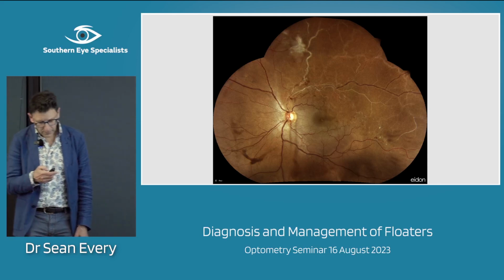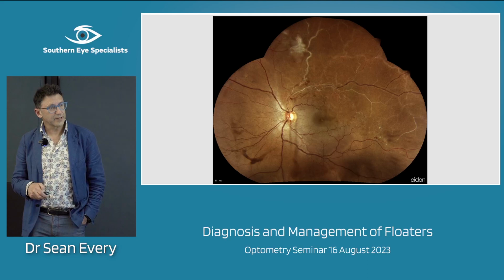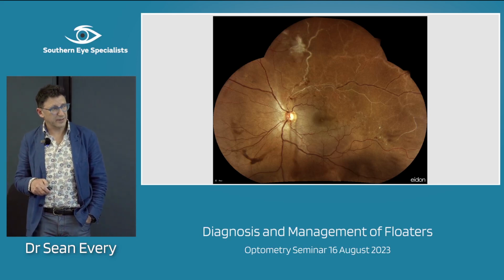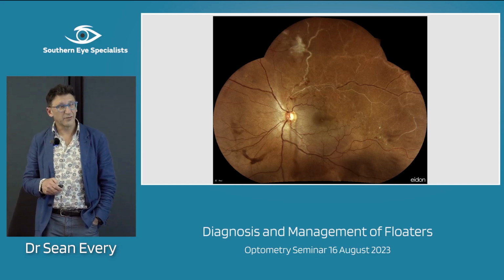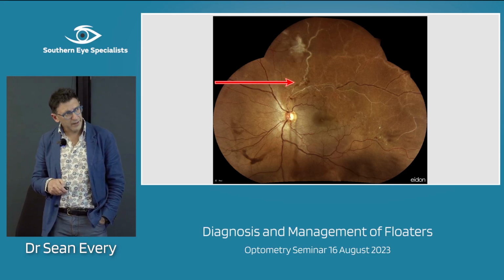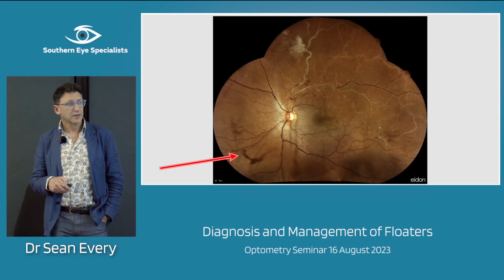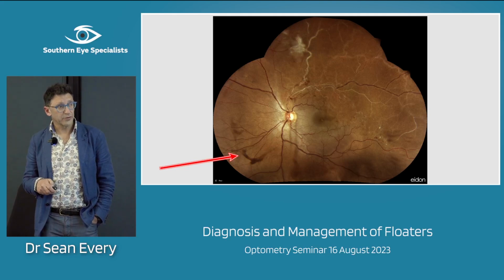So this is a really ischemic supratemporal branch retinal vein occlusion, and it's so ischemic that they've kind of shut down the whole arterial supply as well. So there's virtually no blood supply going through this whole quadrant basically, and they've started to grow a tuft of new blood vessels here and up here as well, and they're bleeding. Okay, so sector PRP all the way through there.